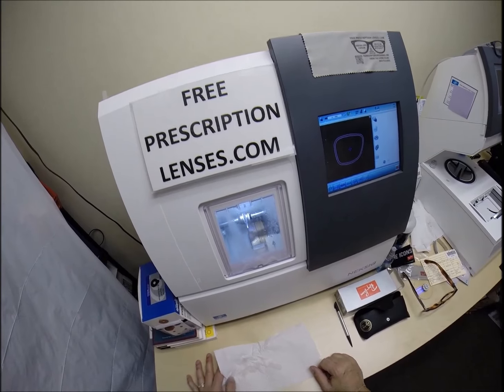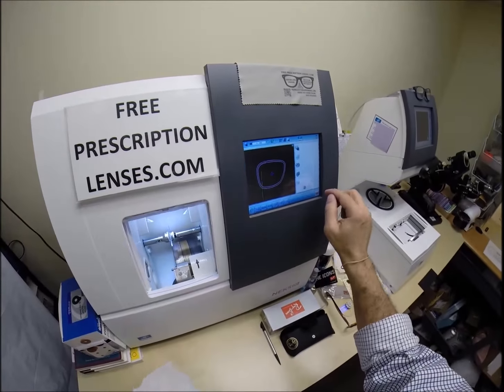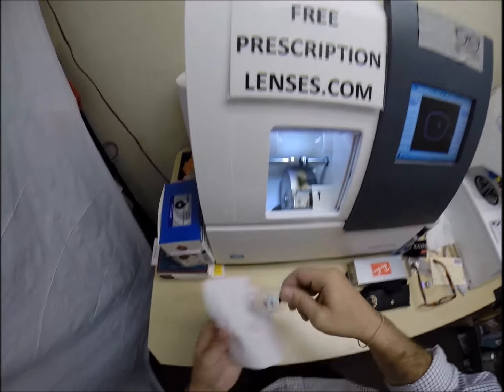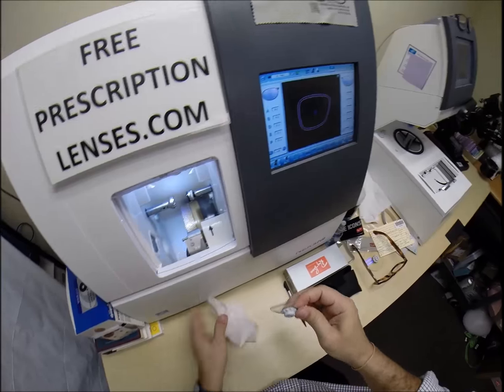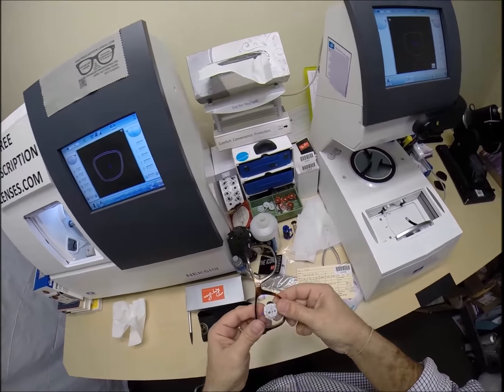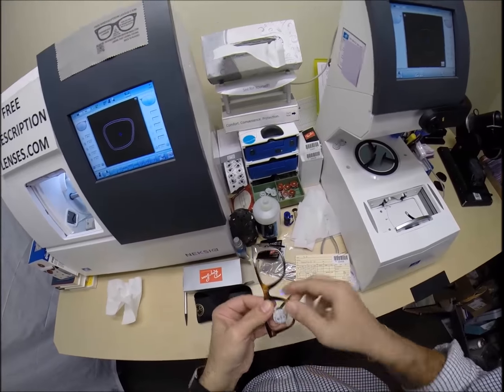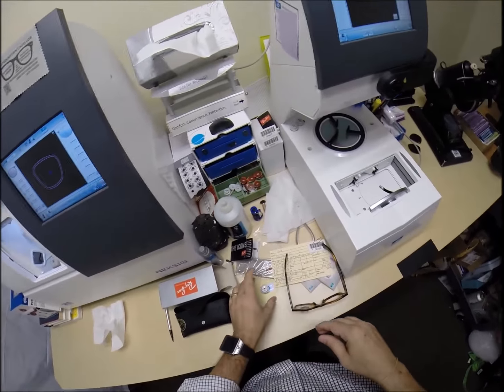So, I'm going to open the door again with my mind. How many times do you want me to do that? Dry the lens off so it's not slippery. Press that on there firmly in case I need to take it down some more. Tuck this in at the outside corner using my thumbs, press down at the nose. Hey, and now it does snap in there.